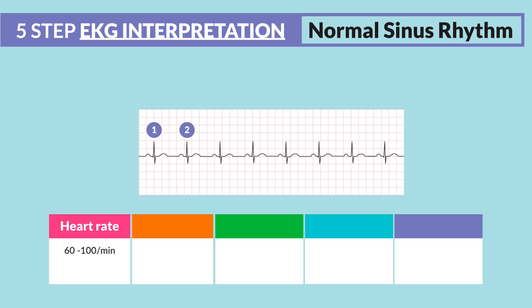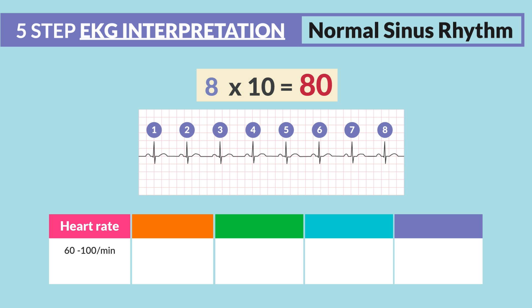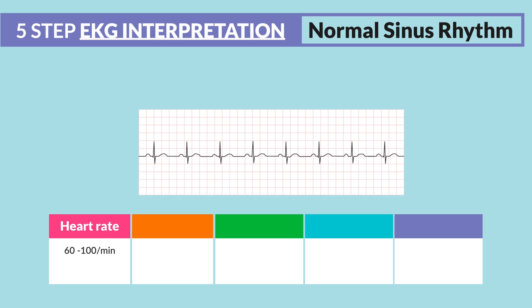We have one, two, three, four, five, six, seven, eight — then multiply by 10, so that's a heart rate of 80. The rate is between 60 and 100. Step number two is the rhythm — it should be regular and evenly spaced apart.